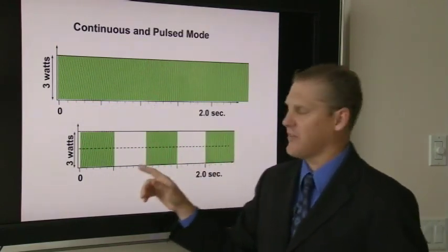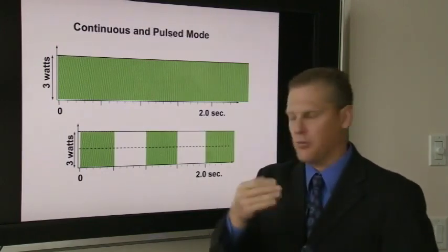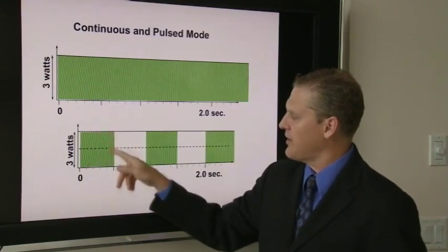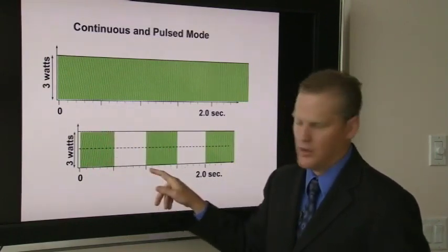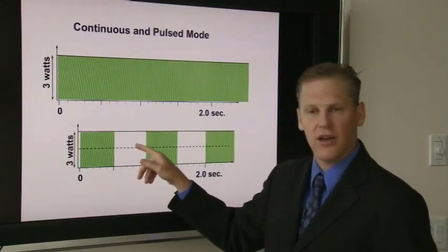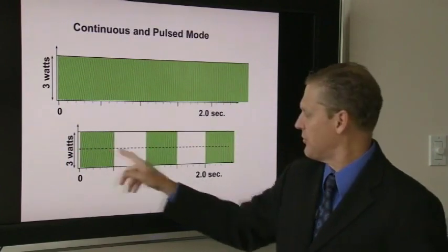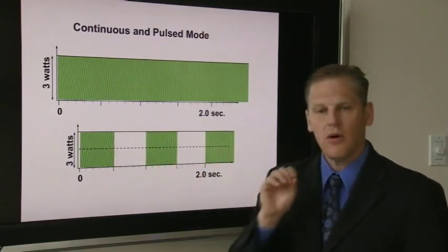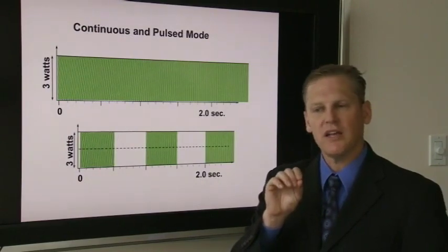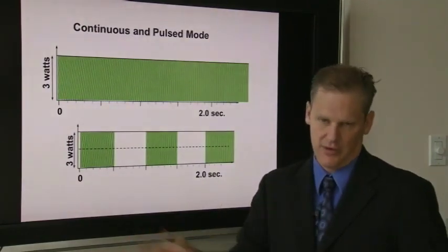If you have a pulsed laser, be it an erbium laser, or if you want to chop your beam up, you will find that you'll have 3 watts while you step on it, and then there is an area of tissue relaxation where the energy is not hitting the tissue, and you are able at this point to allow for the tissue to relax between pulses. So pulsed lasers, in some respects, will give you a greater chance to have less iatrogenic damage to surrounding tissue.